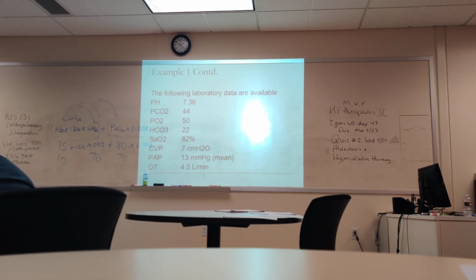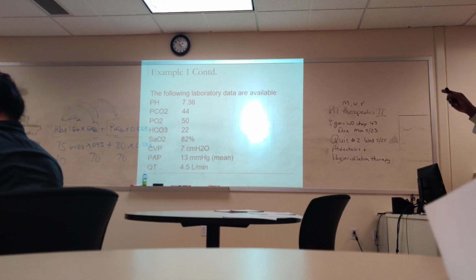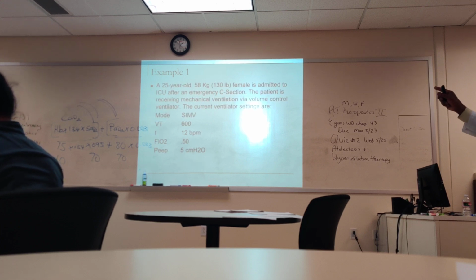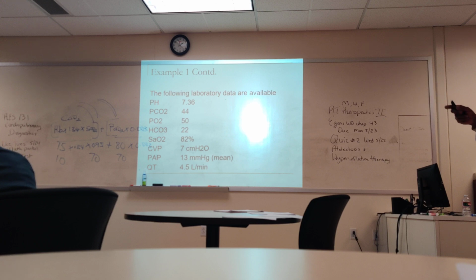Here's the ABG. So we have an acceptable ABG, acid-base balance with moderate hypoxemia. Now, see how they have the hemodynamic values there? You should not ignore those. You always have to read them. Now, CVP, is that good? That's 7. Remember, it's 2 to 6 millimeters of mercury or 4 to 12 centimeters of water, right? So that would be good. So what that means is that that PEEP of 5 is not affecting the right heart. So we're okay. Then we move on to the lungs here.